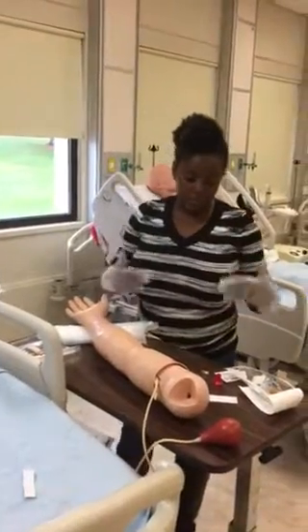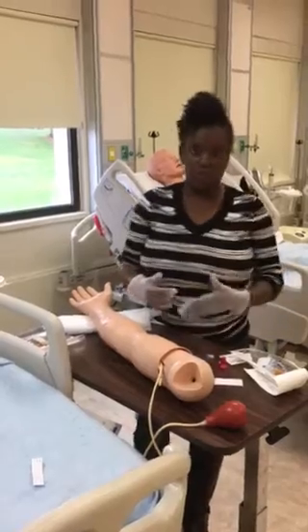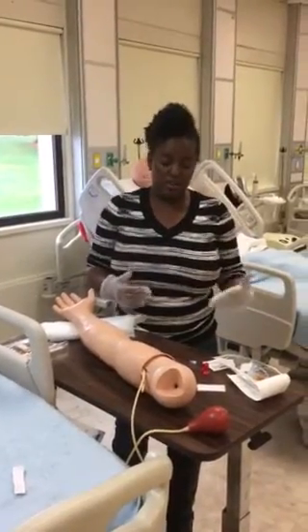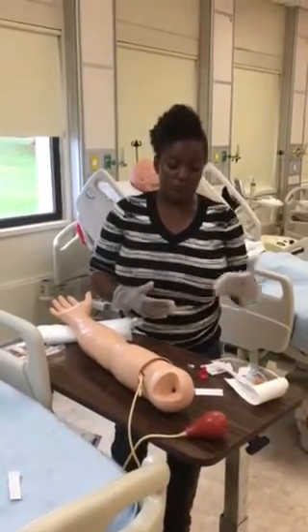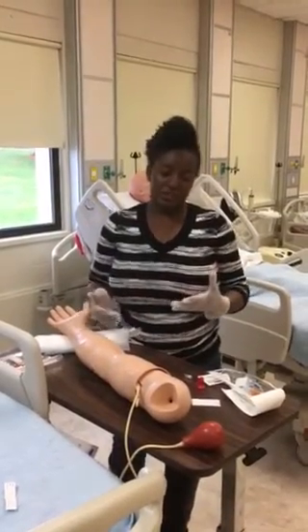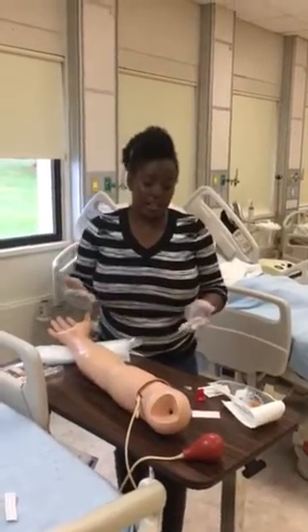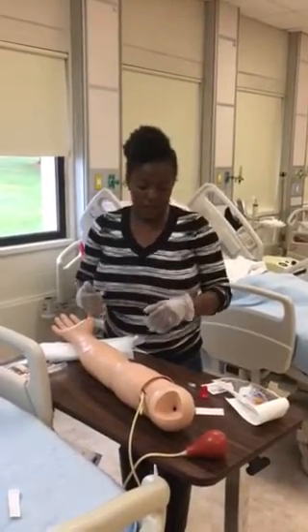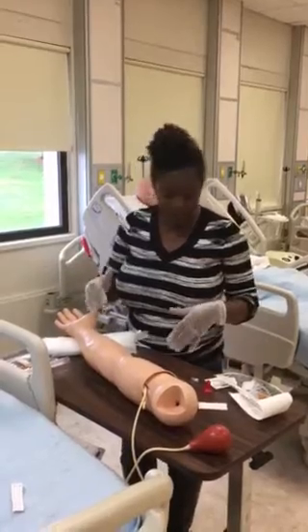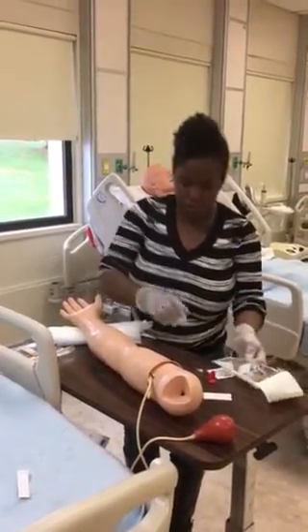After I introduce myself to the patient, I go back to the patient chart. I record if the patient is on room air. I record the FiO2. And of course, I identify the patient, make sure I have the right patient by telling them to verify their last name and date of birth, and date and time of the test. And I gather my equipment.